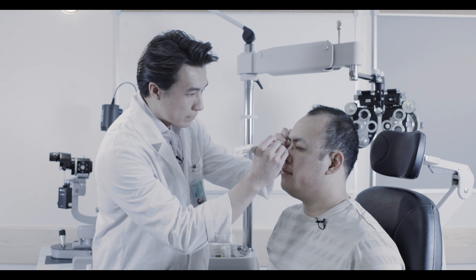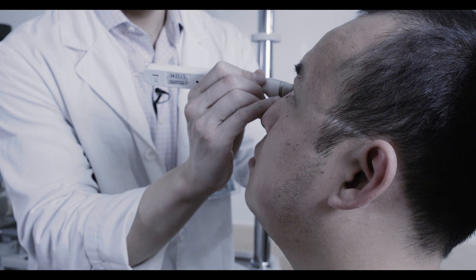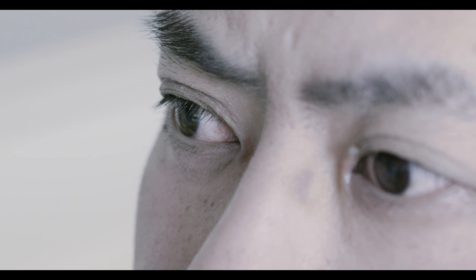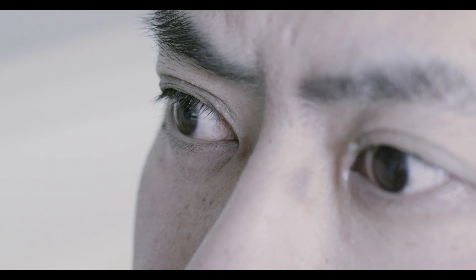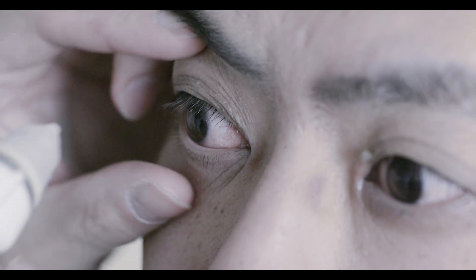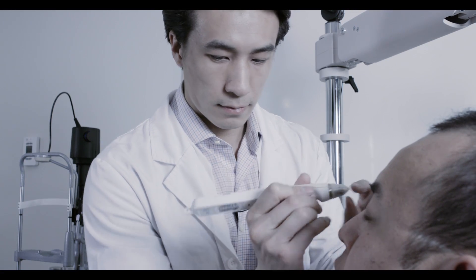Standing first on the right side of the patient, have them fixate on a distant point in front of them. Lower yourself to their eye level and gently tap the tip of the Tonopan so that it makes complete contact with the anterior corneal surface. While gently tapping the Tonopan, you should hear multiple beeps. A final louder beep indicates that a final measurement has been achieved.